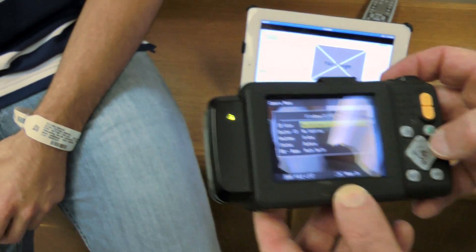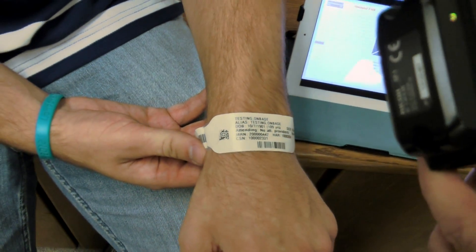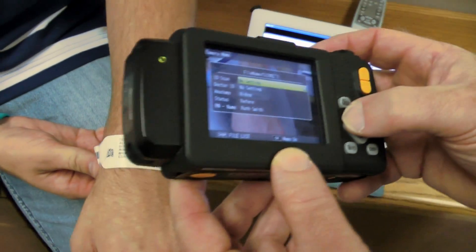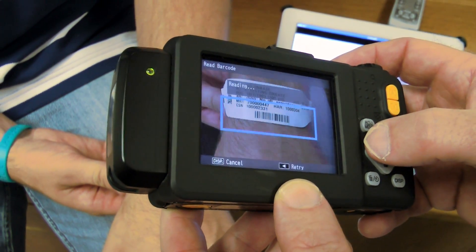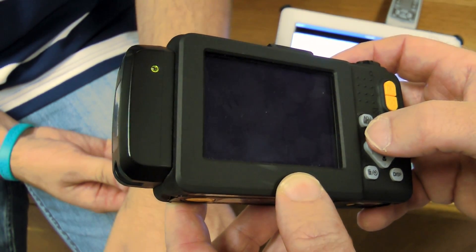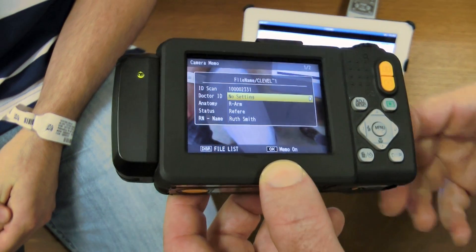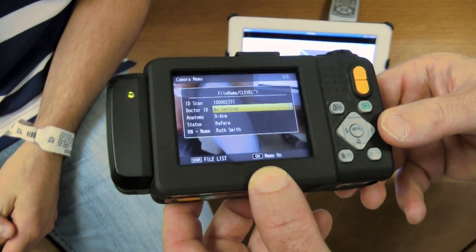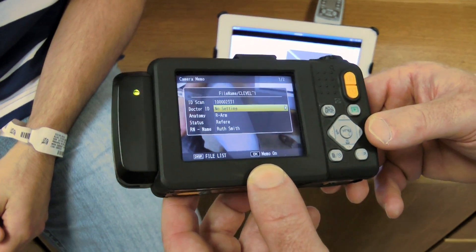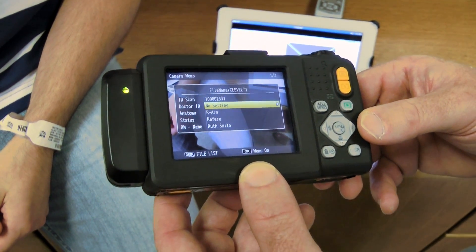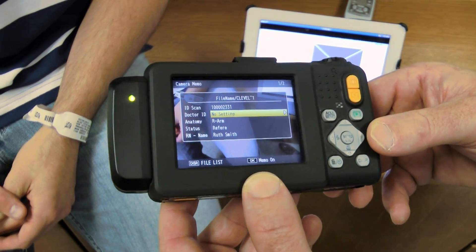So barcodes like on a patient wristband? Correct, like so. Here's my patient Kevin. We're going to activate the barcode scanner. There, as you see, Kevin is now tagged. How did it scan the barcode? Did it scan it with some attachment? No, that is built right in the lens.